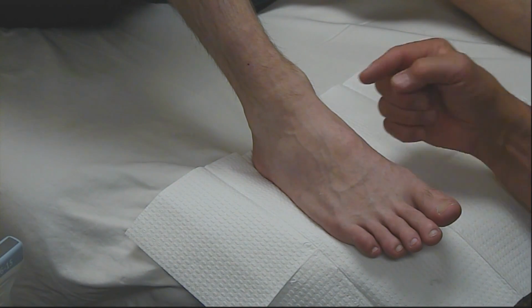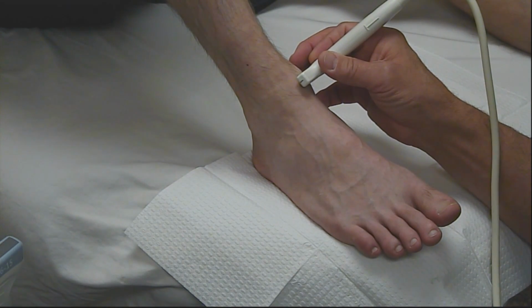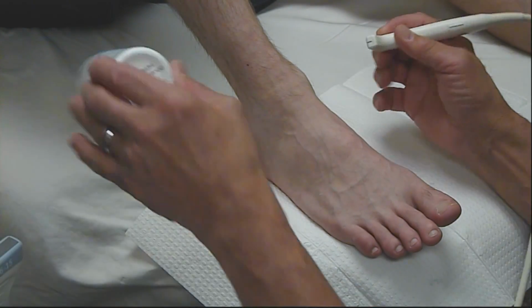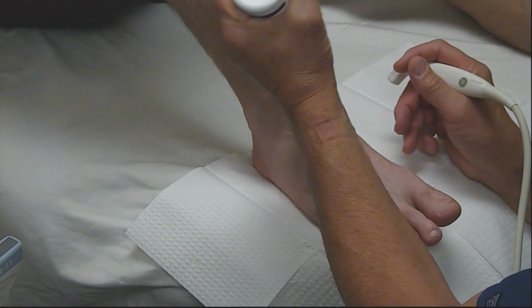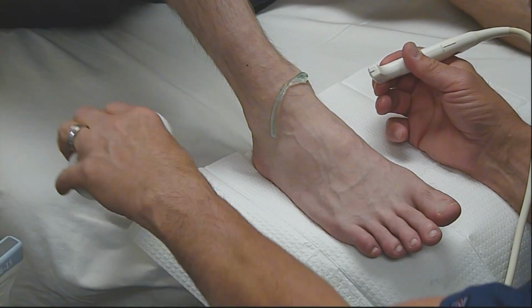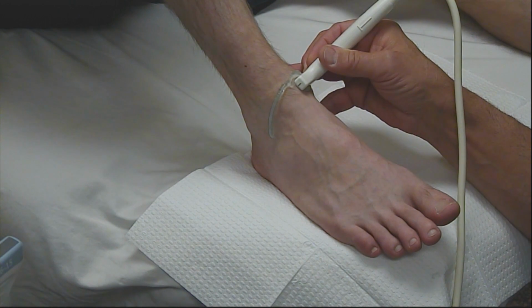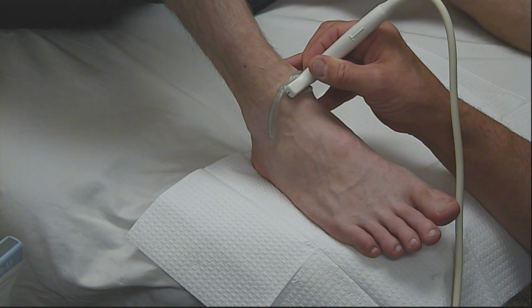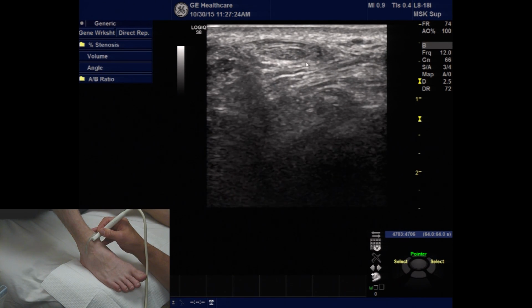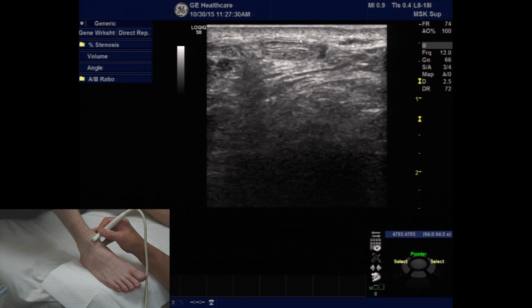In our process, we'll place the transducer in a short axis position across the distal aspect of the tibia, and we'll evaluate the tibialis anterior, also known as the anterior tibialis. Placing some gel across the anterior part of the ankle, we'll go ahead and place the transducer right at the distal end of the tibia, and we'll look for a large oval structure sitting very close to the surface of the transducer, which is the short axis of the tibialis anterior.